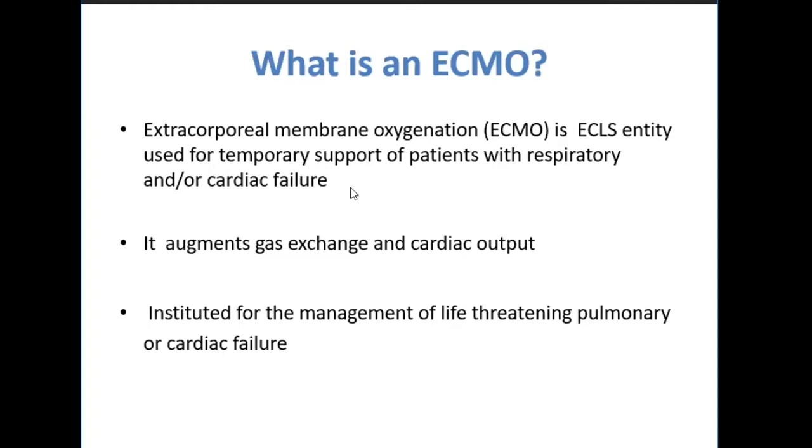This is used as a temporary support for the patient with respiratory and cardiac failure. It augments the gas exchange and the cardiac output. As you know, in extracorporeal support we use a membrane oxygenator and pump, which actually improves the gas exchange and the cardiac output. It is instituted in the management of life-threatening pulmonary or cardiac failure. This is very important. We'll come in detail about when we should consider ECMO in such situations, but the situation must be like this.